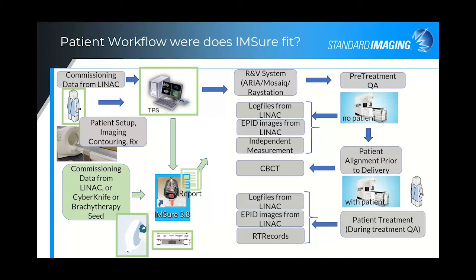So the second check of your treatment planning dose has a separate beam model created with different data. And so we, of course, commission data for IMSure's beam model, be it a LINAC, the brachytherapy source model representation using the TG43, as well as the CyberKnife. So we have that specific beam data going into IMSure. And so you can consider that a verification step.